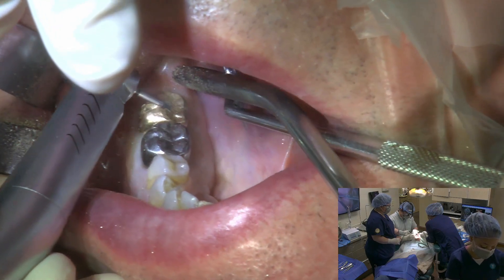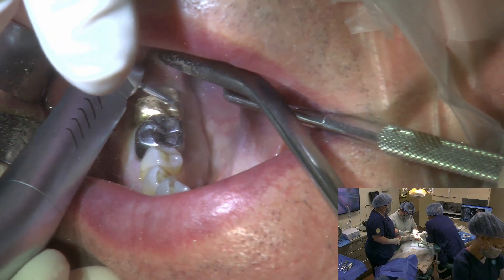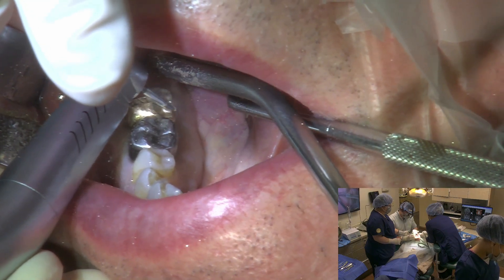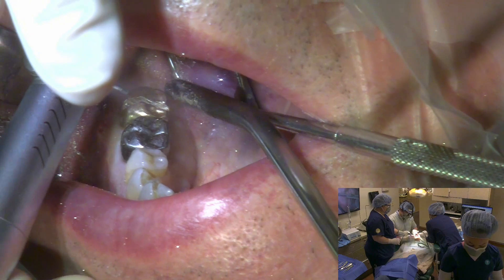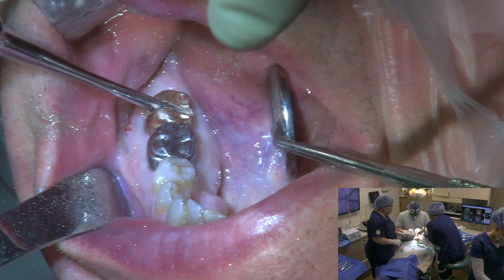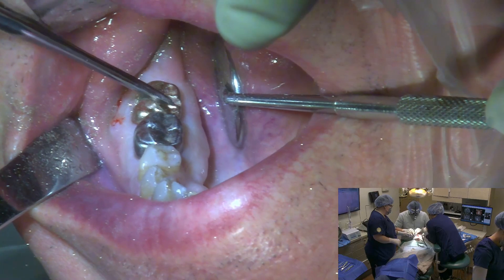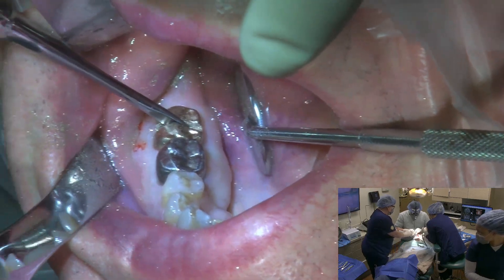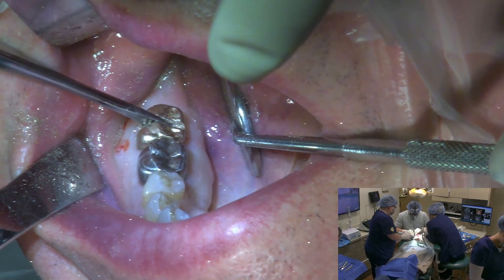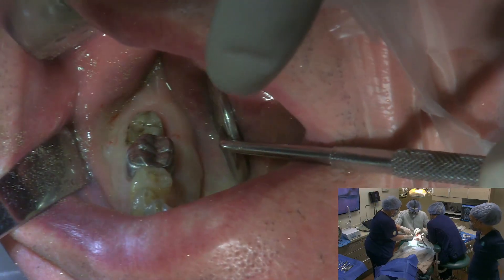You usually don't have any issue with cutting through the crown. You've had a root canal done on this tooth so the nerve is no longer there. Alright, beautiful — the crown is off.